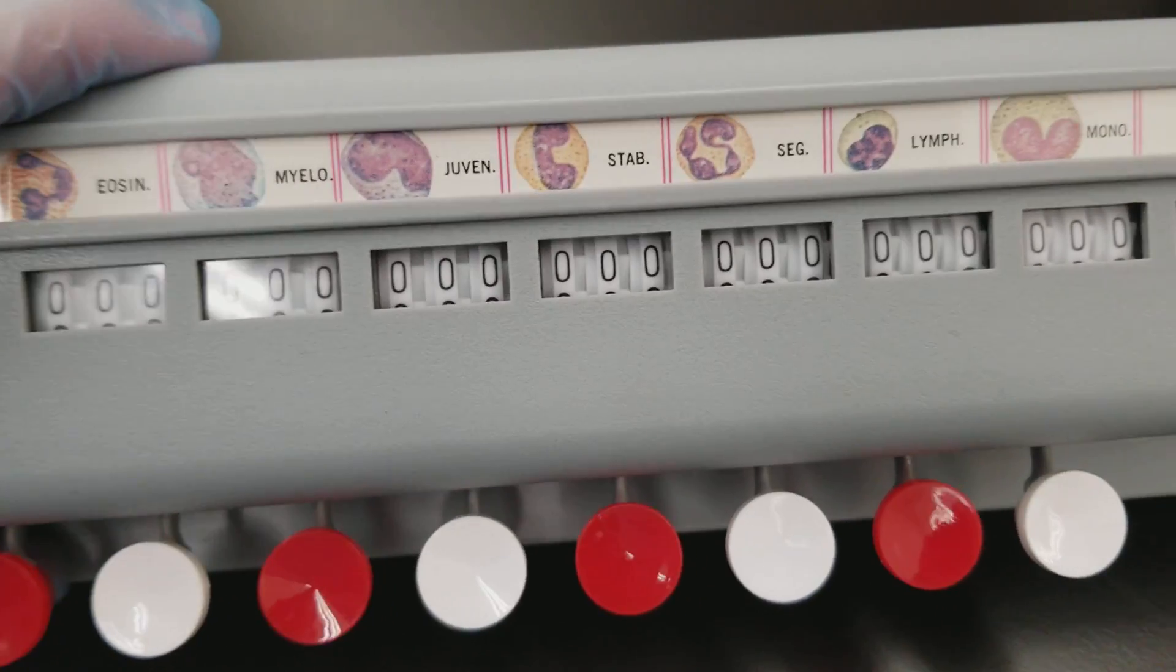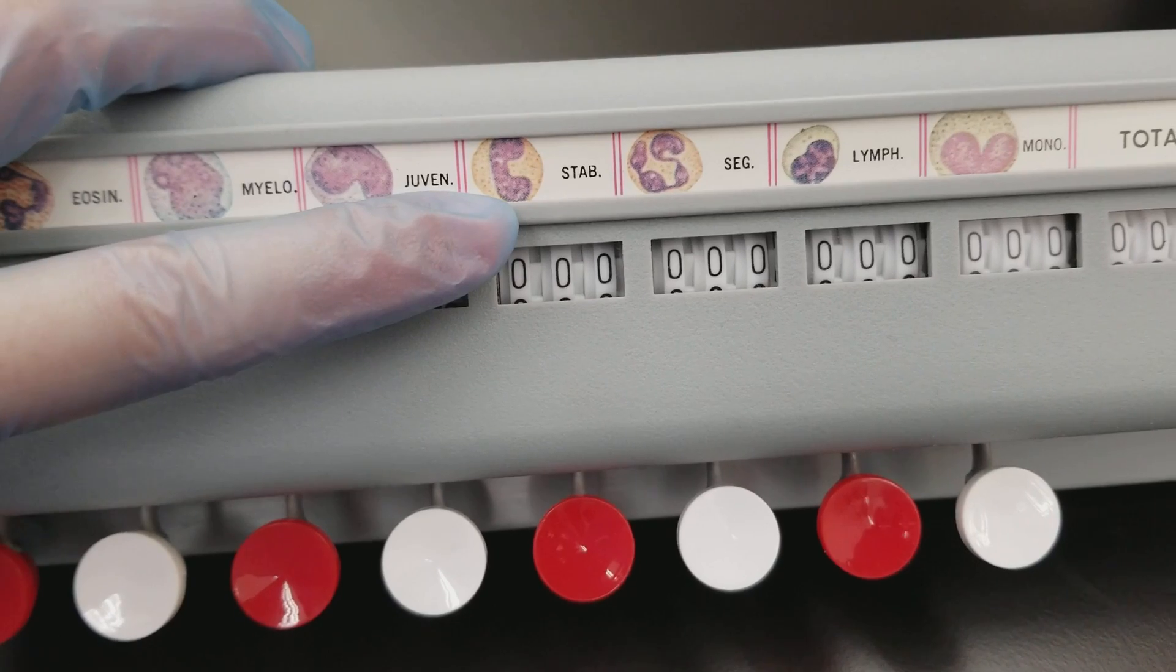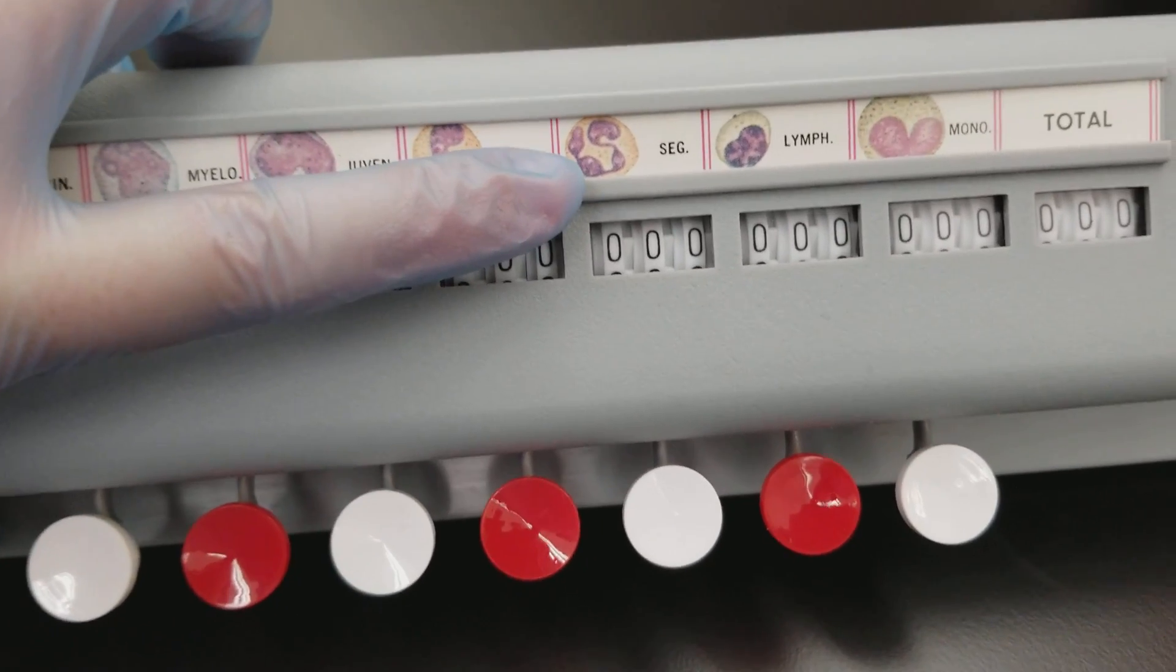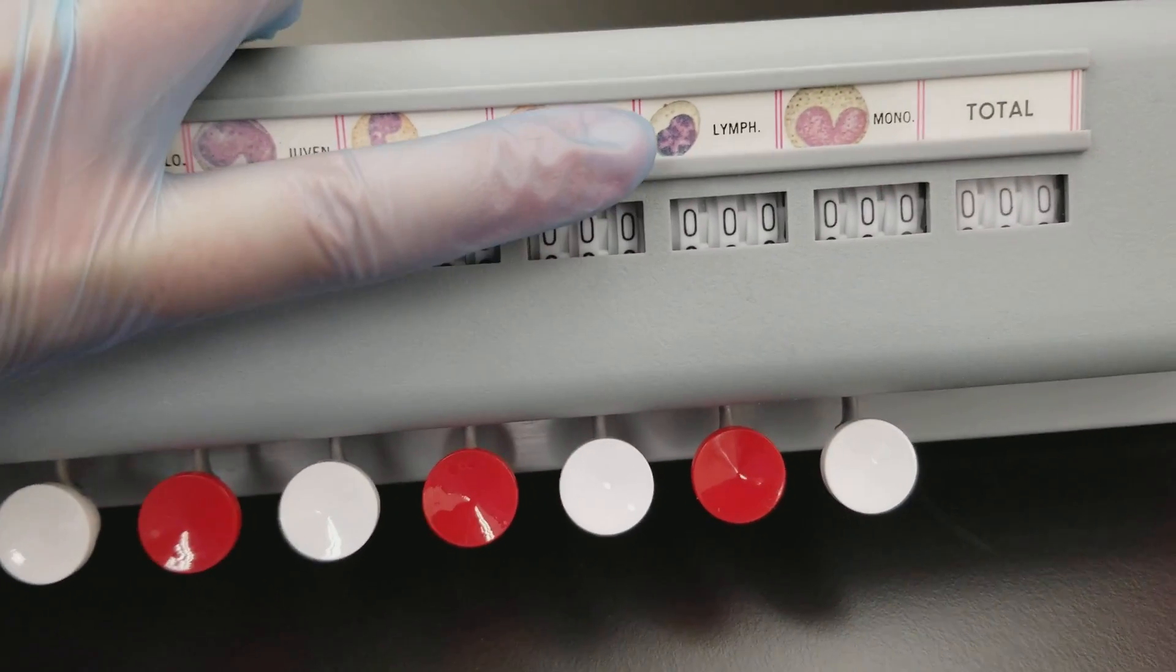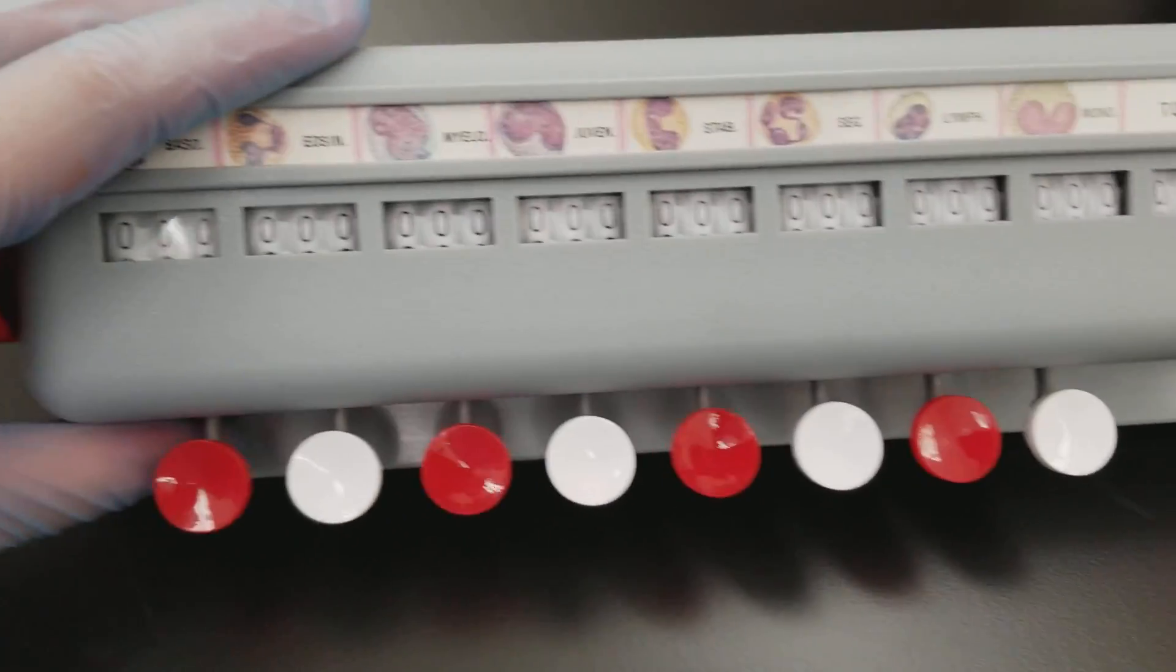Juvenile myelocytes. Then you have bands and segmented neutrophils. Then you have lymphocytes, monocytes, and then you have the total over there.